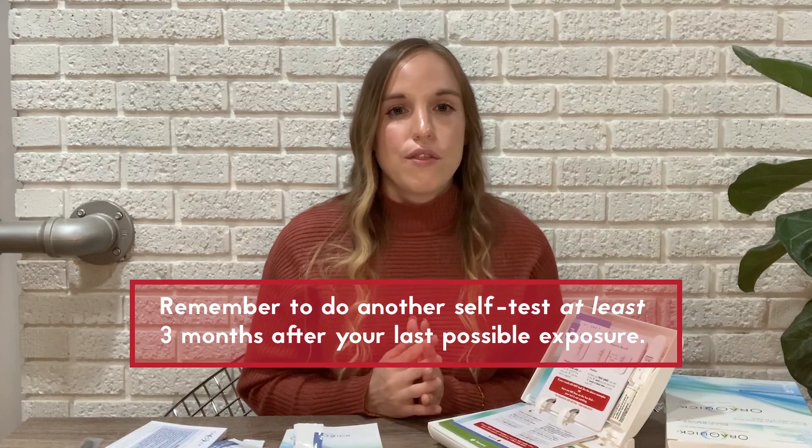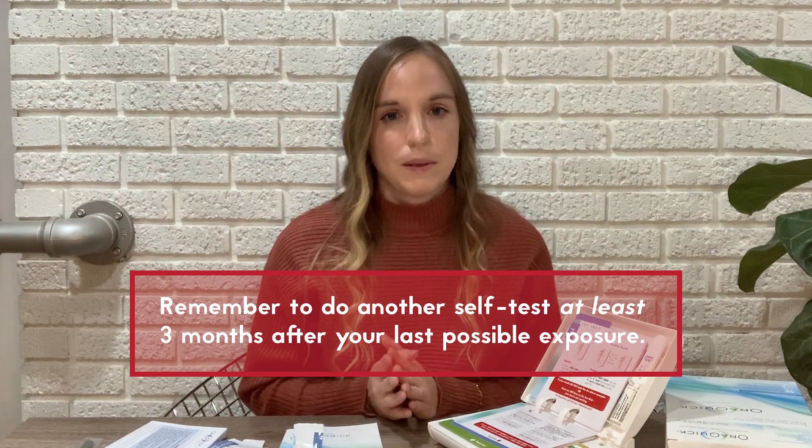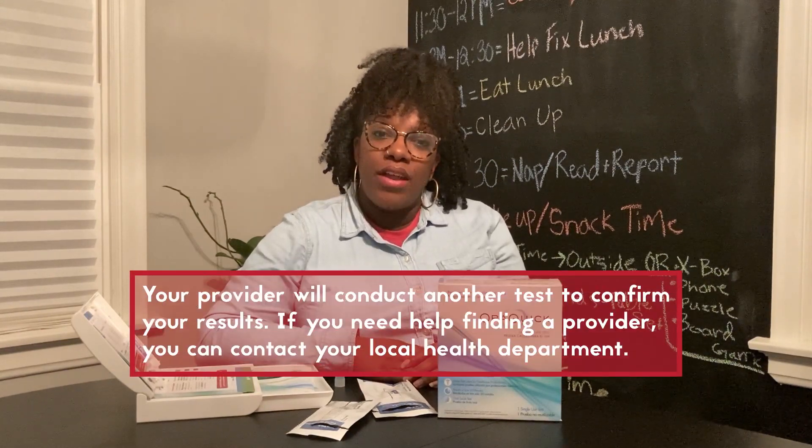But it's not as simple as positive or negative. It can take up to three months for HIV antibodies to show in your body at levels that the test can recognize. So if you think you might have been exposed within the past three months, it's really important to repeat the test. And if your result came back positive, you'll need to follow up with a healthcare provider.